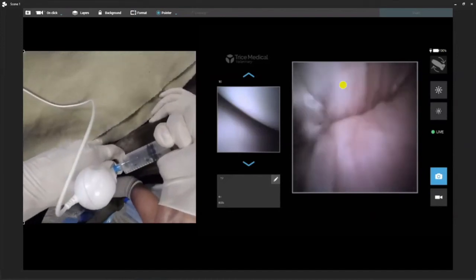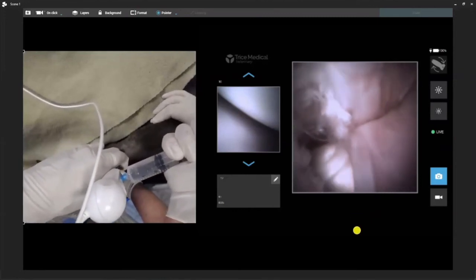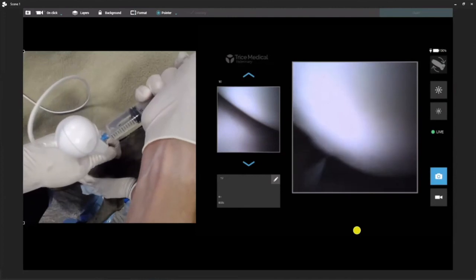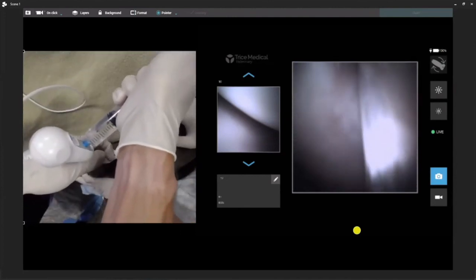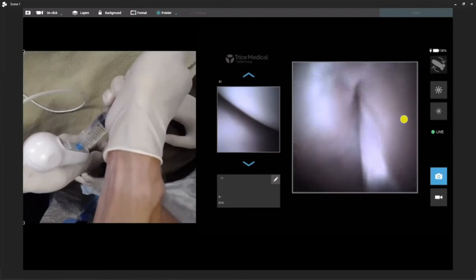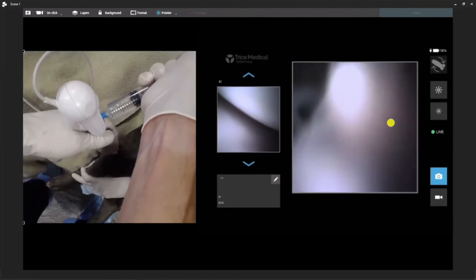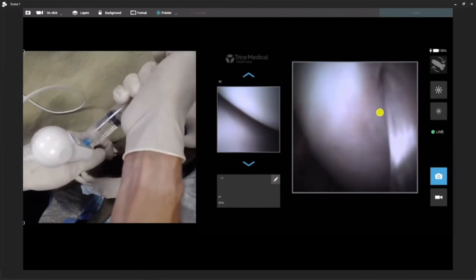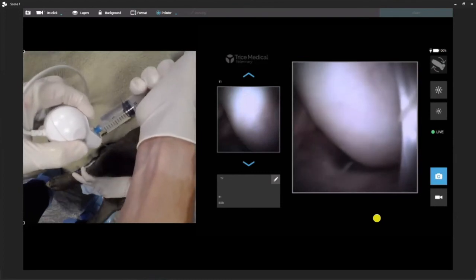So I think you guys can see — we saw a medial compartment, we saw a lateral compartment, we saw the posterior cruciate ligament, the anterior cruciate ligament, ACL, PCL. We saw our meniscus very nicely. And then a question for all the interns and residents watching — what is that structure right there? Look how shiny it is — look at that image quality. Very, very nice image quality. We were able to drive with a zero degree all the way around the stifle. And that's it.